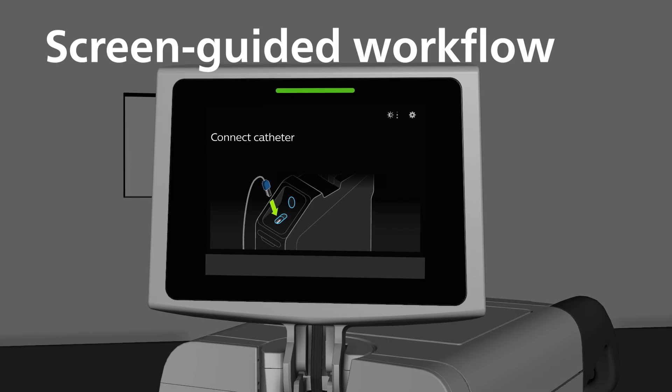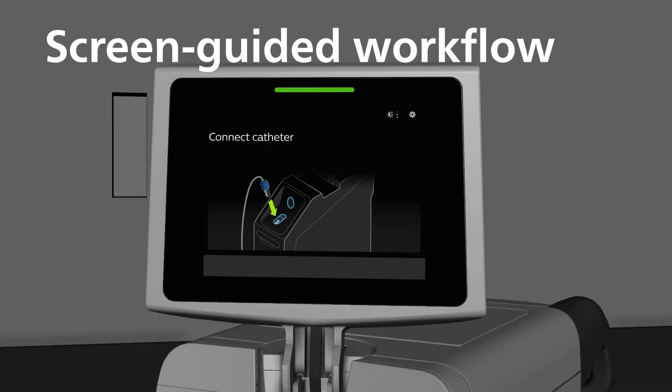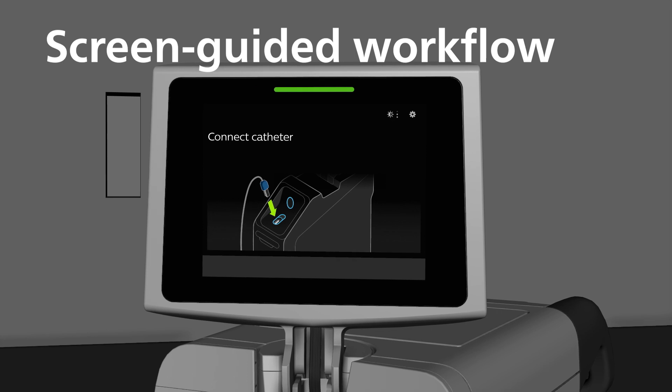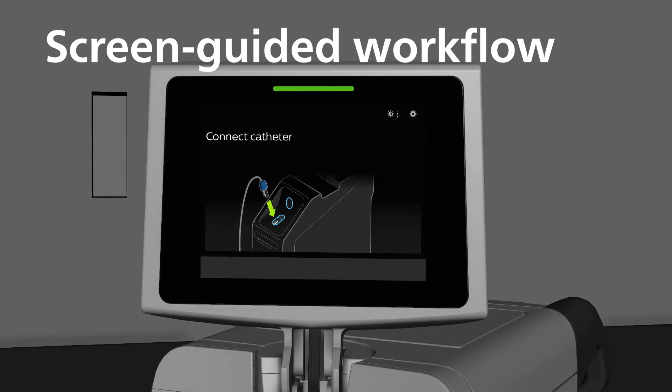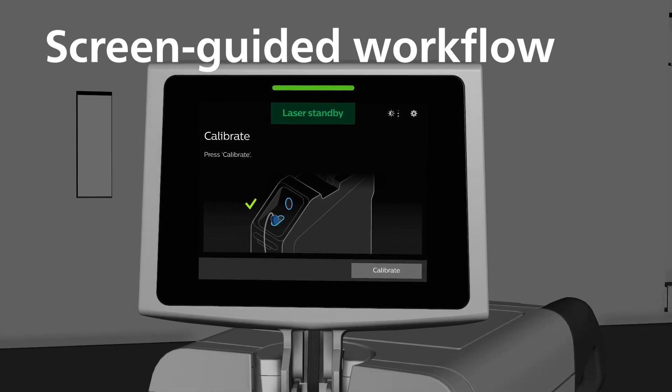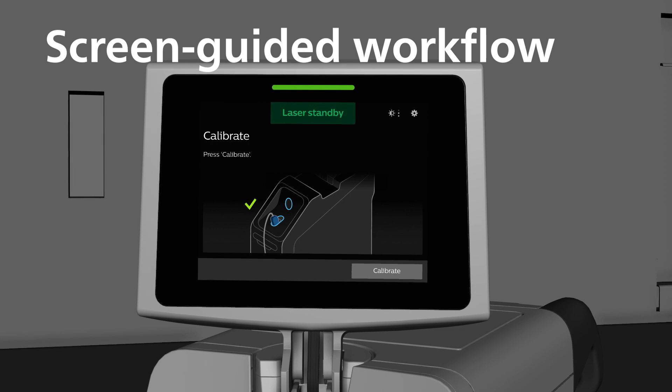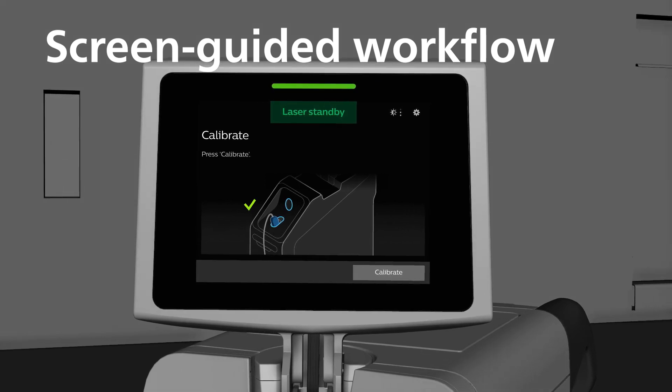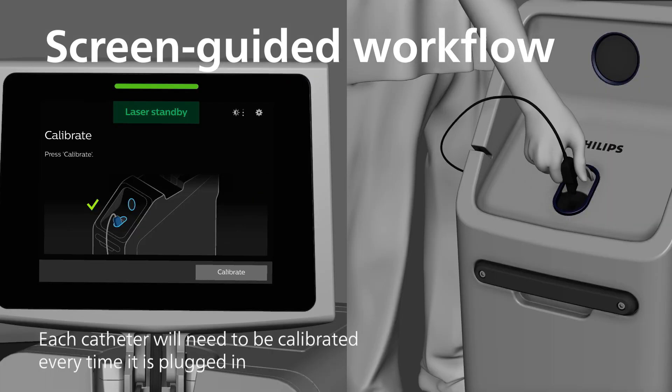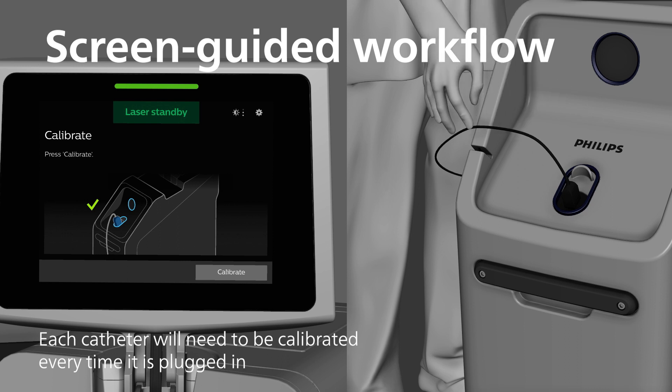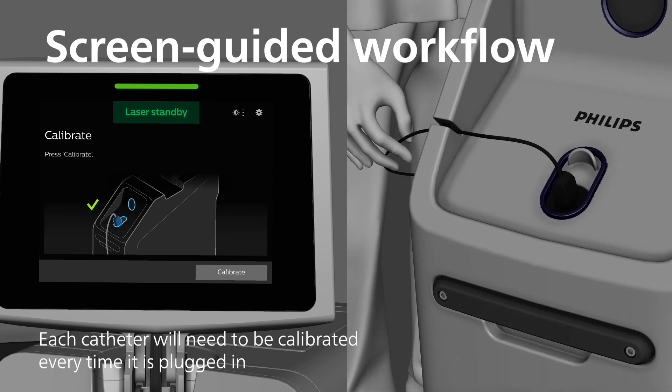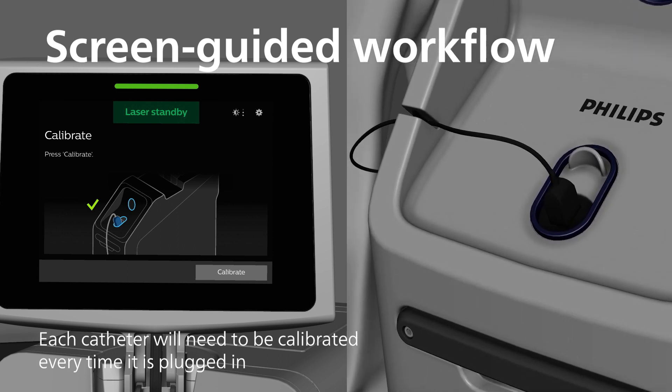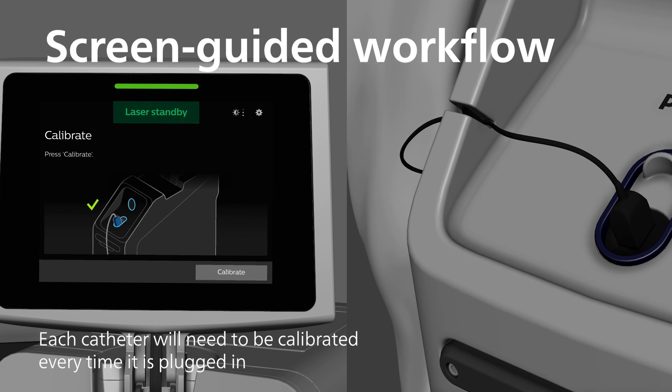When initialization completes, the system will present the connect catheter screen prompt. It will take less than 30 seconds for this screen to appear after the system is powered on. Insert the desired catheter for the procedure. Use the provided catheter retaining feature to hold the catheter away from the detector during calibration. This will provide more clearance from the sterile area.